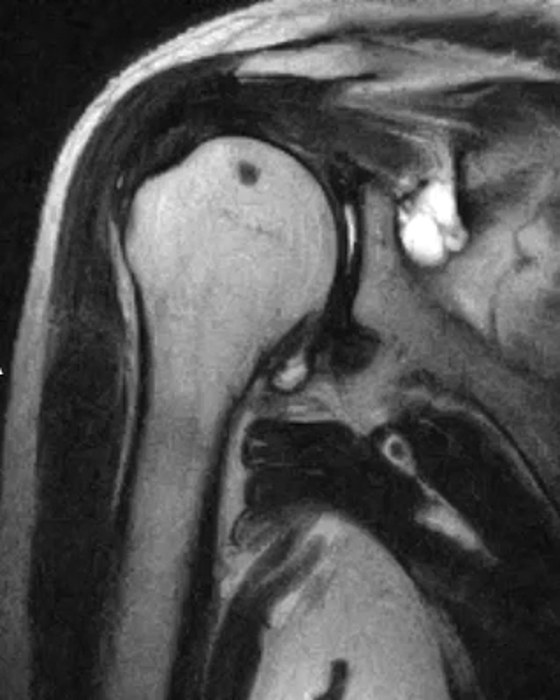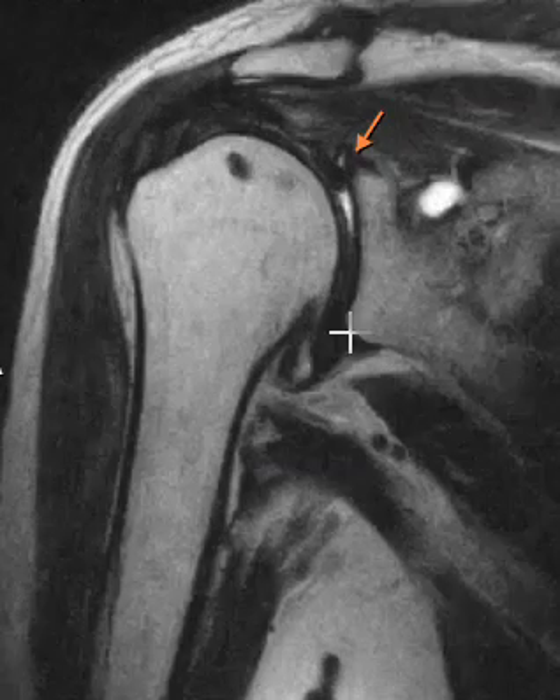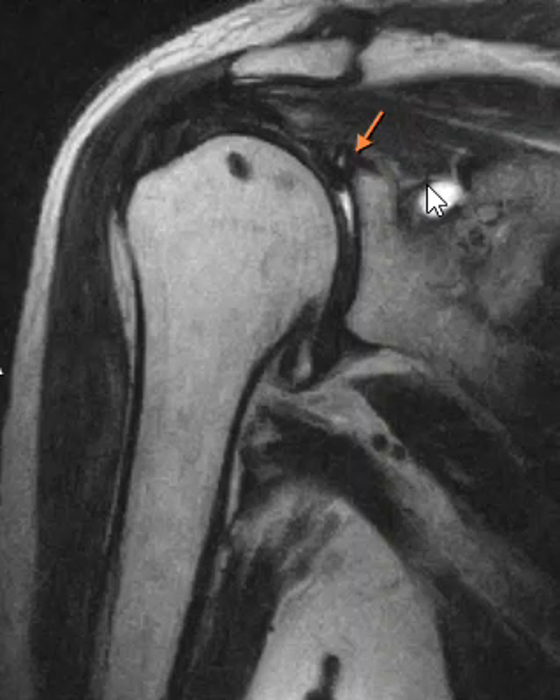Hello, this is Dr. Gay from First Look MRI, and this is a quick case of a paralabal cyst that's pinching a nerve. Here we go — this is a patient who had shoulder surgery not that long ago. Their rotator cuff was thick but it looked like it was intact, not a full thickness retear.